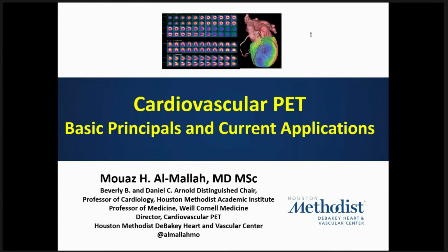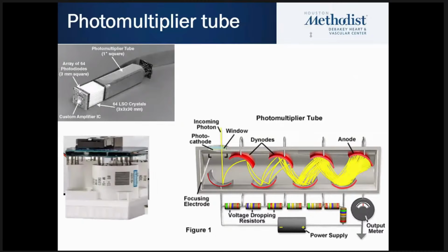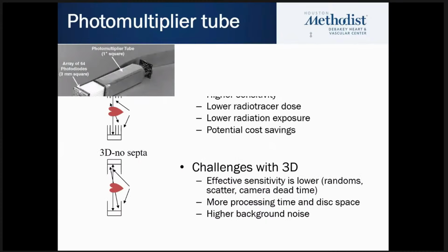And Dr. Mamarian, a few weeks ago, talked about perfusion imaging, about how PET is different than SPECT and the things that differentiate PET from SPECT myocardial perfusion imaging.